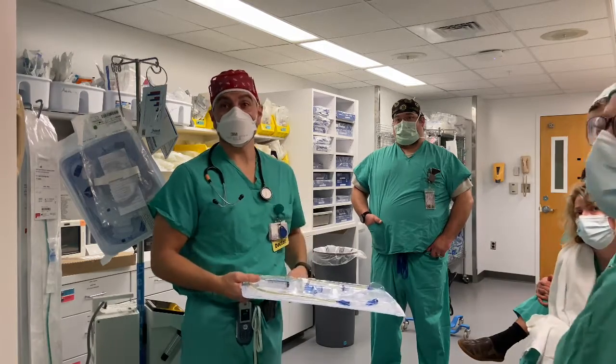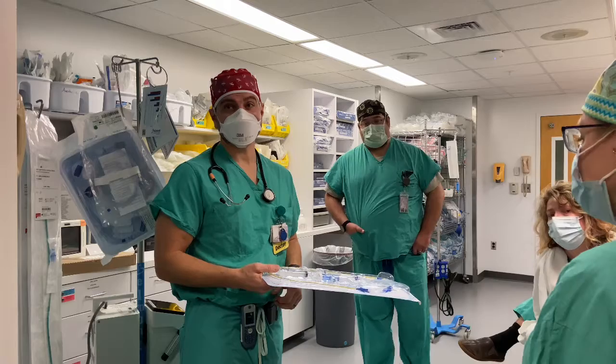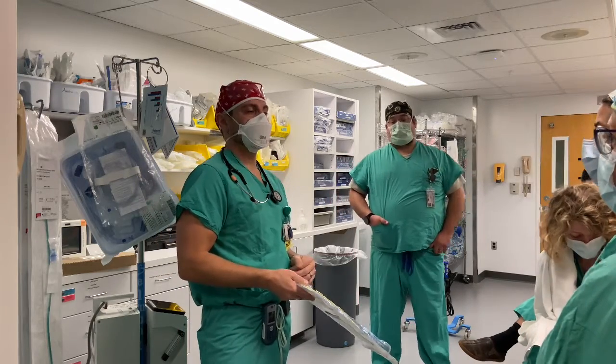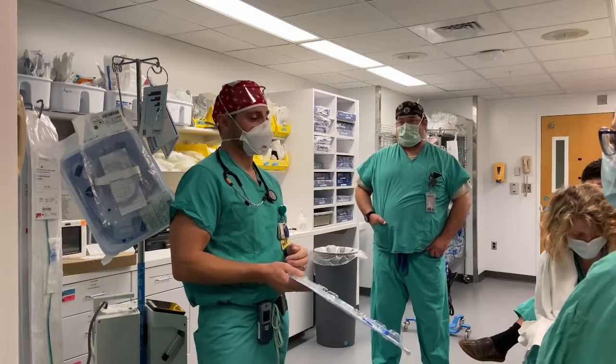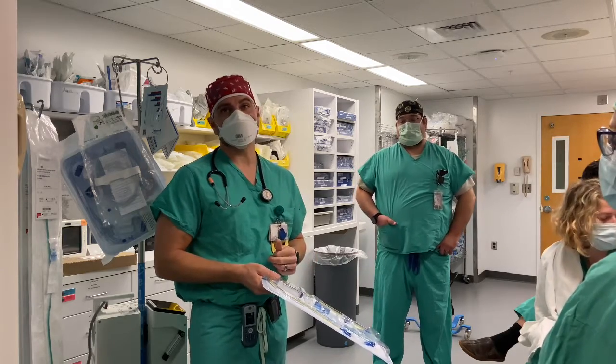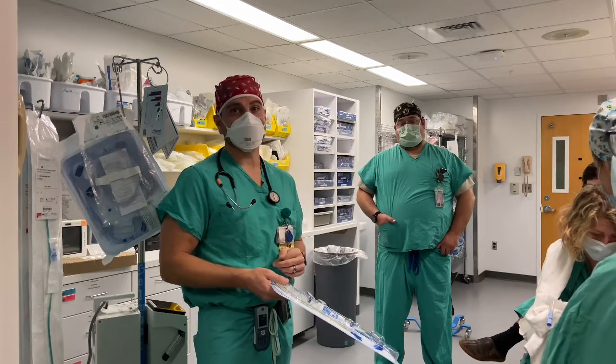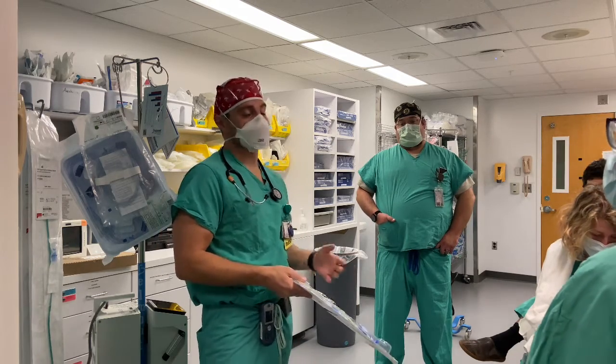So, yeah. Is that why in pediatrics they use the bronchial blockers instead of dual lumens for intubation reasons? It's simpler? Maybe the case. More often than not with pediatrics, it's just a size thing. Okay. So there's not a lot of really small double lumen tubes that would be appropriate for the pediatric cases that tend to need lung isolation.